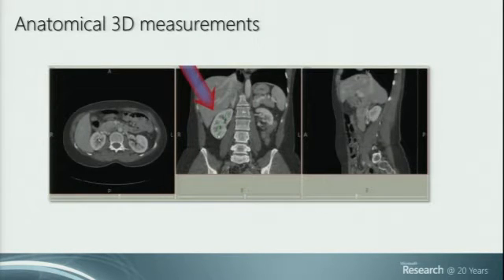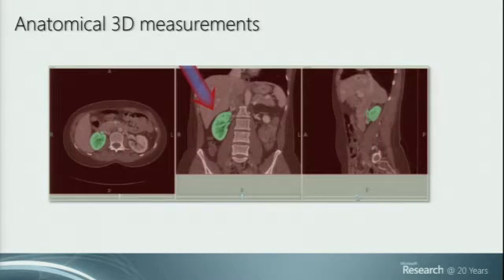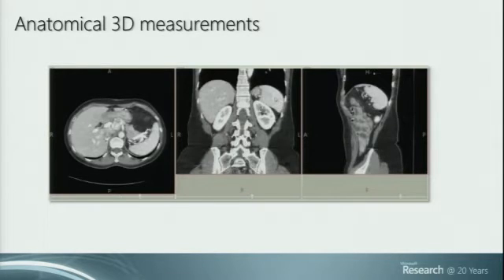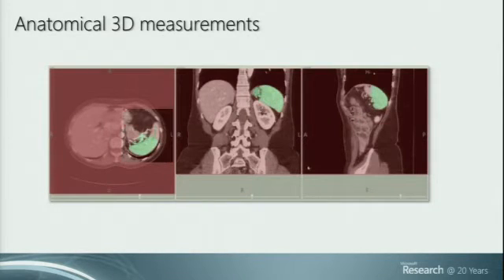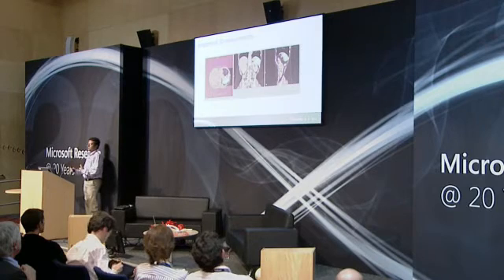instead is this interactive assisted technique whereby, again, we look at the three-dimensional CT scan in three different orientations, and we can interact on one of these 2D planes with the green brush that you just saw, and that is enough to give me a full three-dimensional segmentation of different organs. We saw the kidney being segmented in green earlier, and now the spleen. So all of this is now done extremely efficiently.